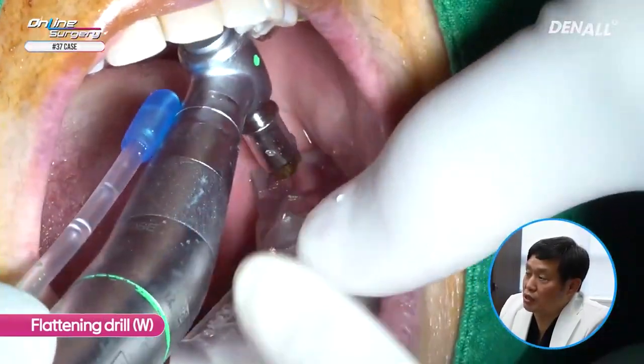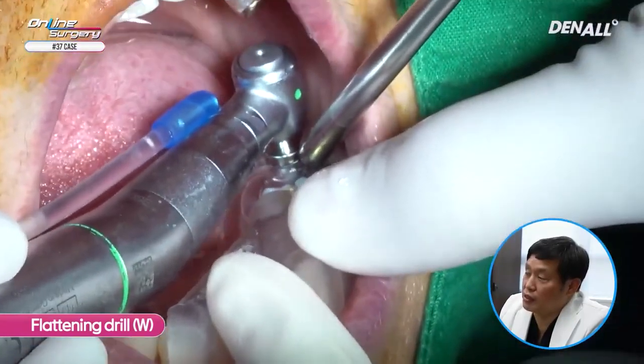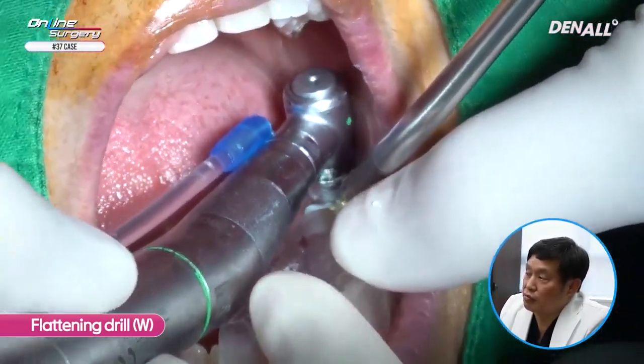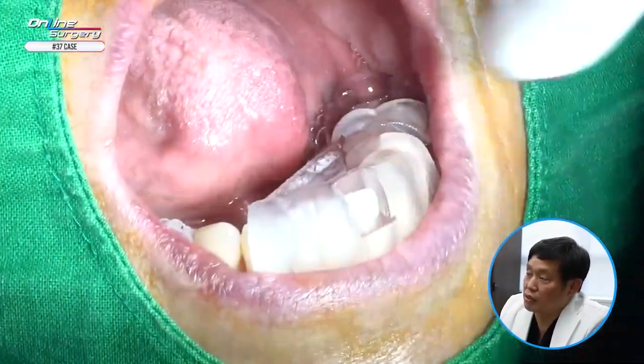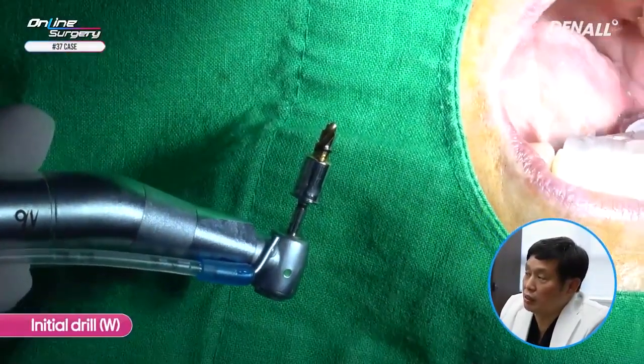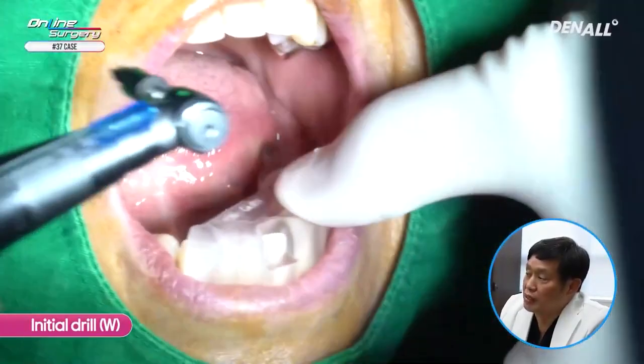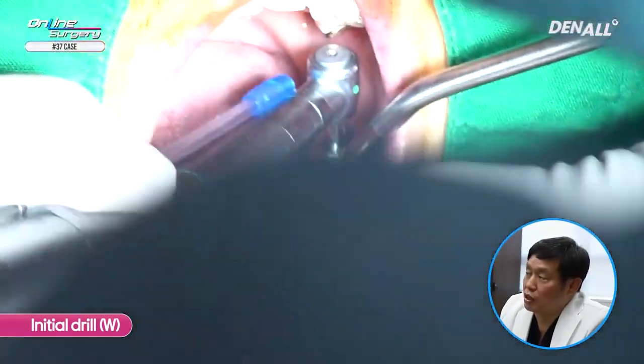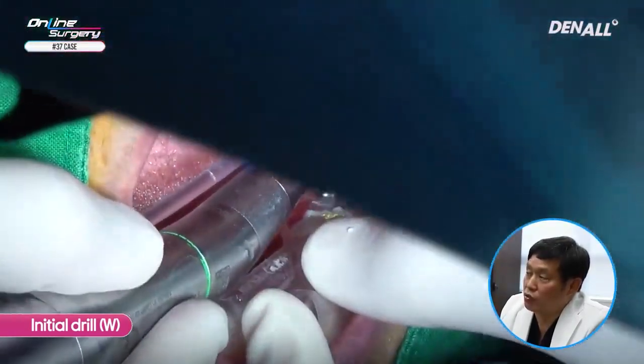When you use initial drill and if full drilling is not done, you can use flattening drill once again. And then you'd notice that initial drill would go in full length. Initial drill needs to be done full length for you to be able to utilize double contact concept when drilling using other drills.